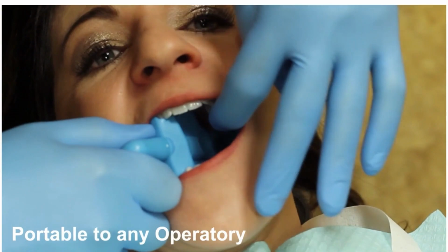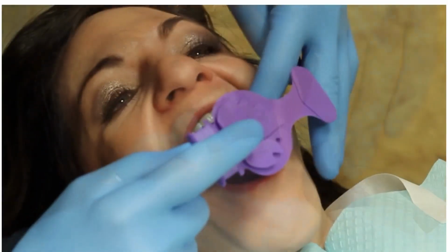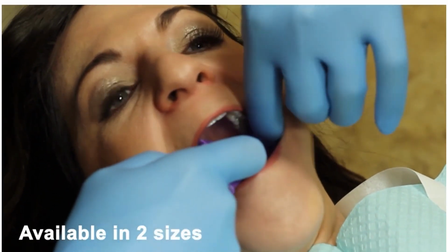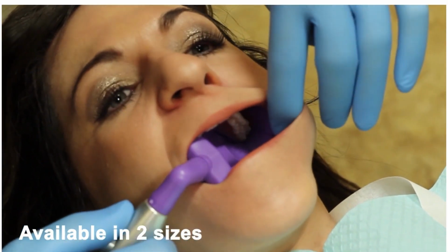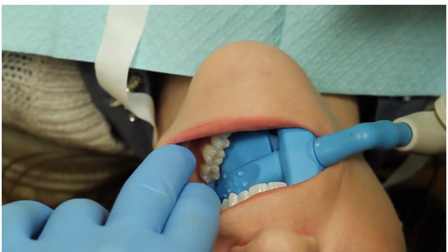Now, there are times when some clinicians like to put it behind the last molar and then slide it. Personally, I like to get the bite block in first, only because I felt like it made it easier. But again, there's no right or wrong. Make sure too that you don't capture the patient's lip in that, because you definitely don't want the patient to get an area where they hurt their lip, okay?